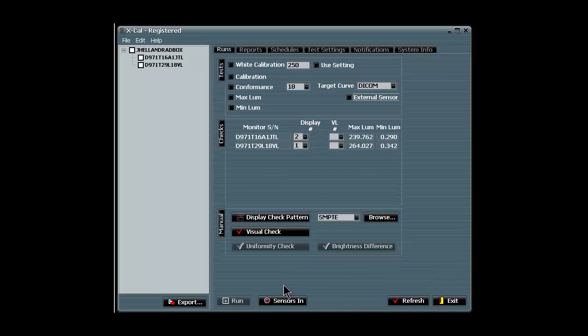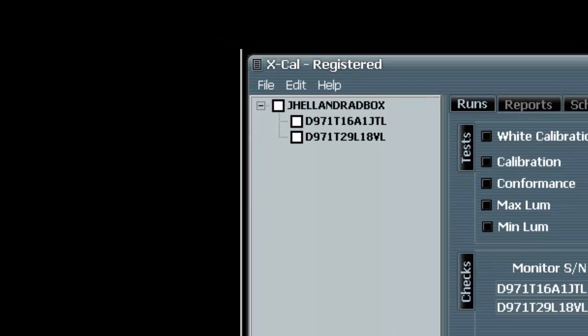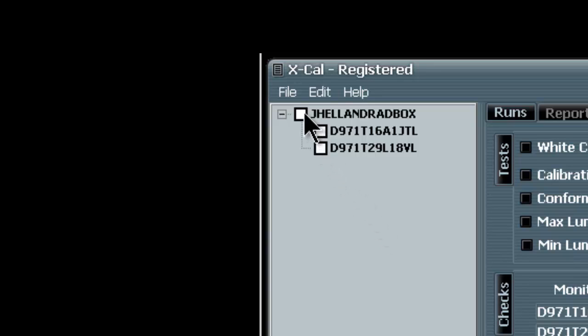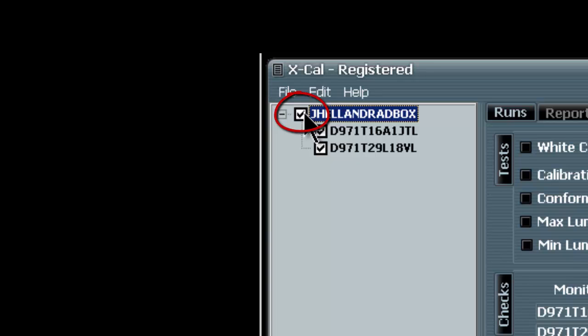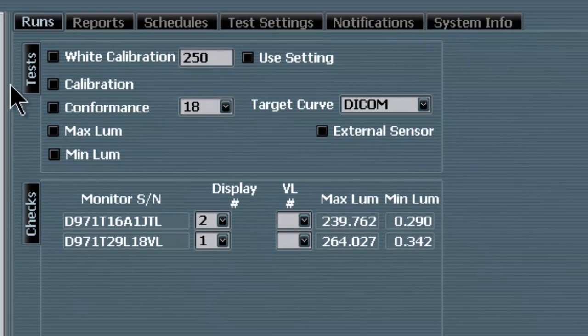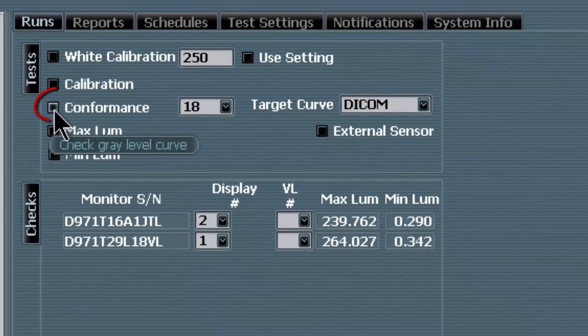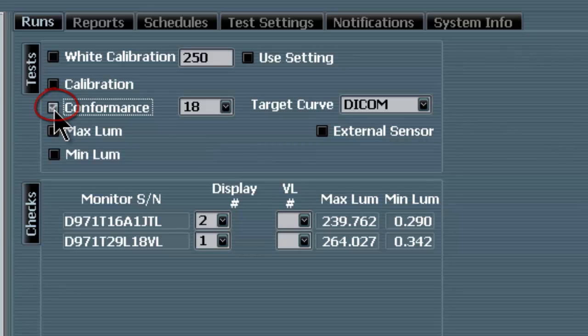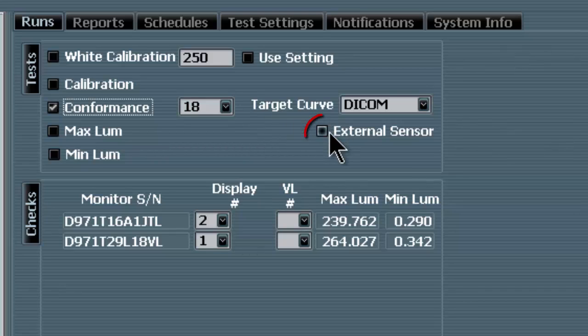We must select the appropriate testing criteria from the XCal menu. First, select the monitors using a checkbox in the left pane. Next, in the Tests menu, we will select the conformance checkbox. Also, within the Tests menu, we will check the external sensor checkbox.